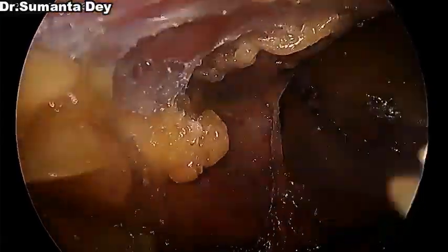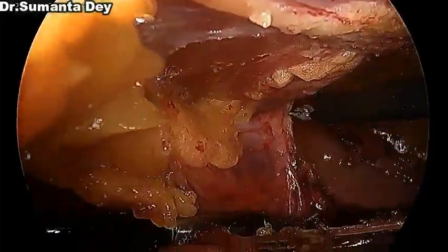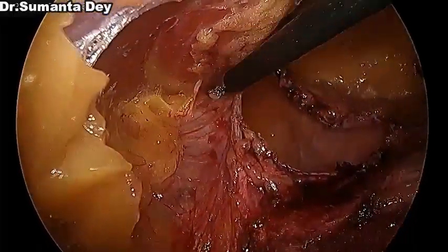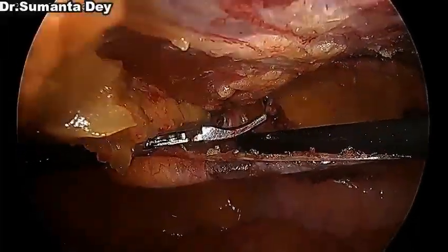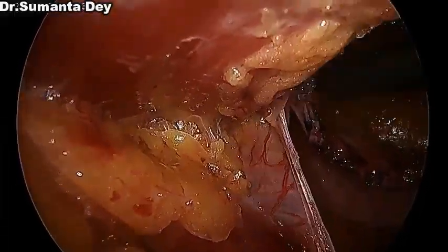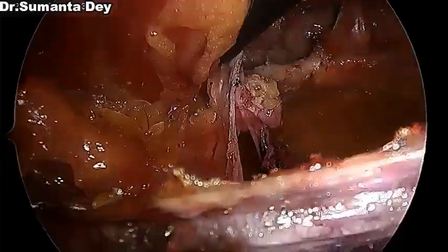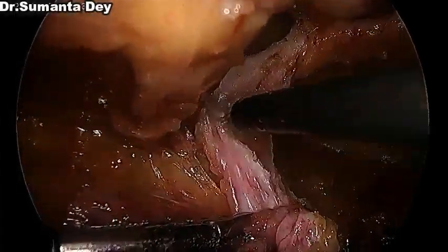Traction, counter traction is equally important while doing any laparoscopic surgeries. So lower down on the medial aspect, it's the rectus muscle. You can see the reddish rectus muscle. So medially on the left side of the screen is the lateral abdominal wall, and on the right side of the screen there are rectus muscles, and right and left rectus are there together.